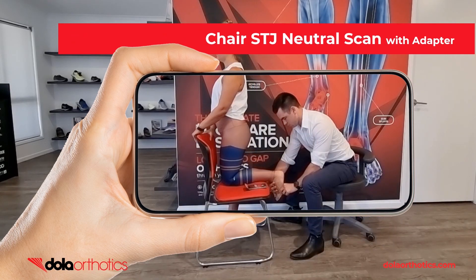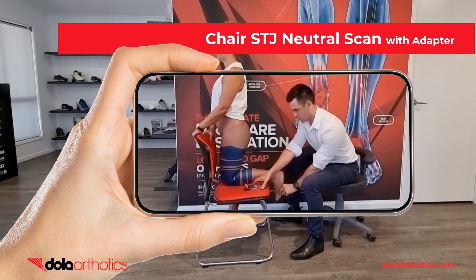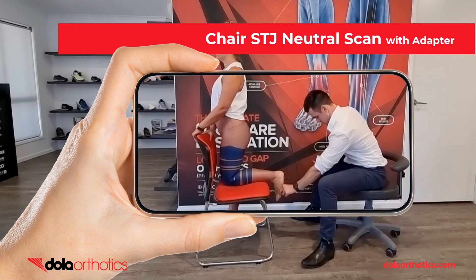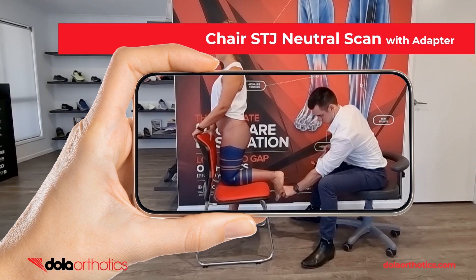Here is a demonstration of the iPhone with Dollar iScan adapter being used to scan the foot using a chair for patient positioning in challenging environments including home visits, consulting rooms and mobile clinics. The clinician is able to hold the foot in subtalar joint neutral just like completing a traditional prone plaster cast while completing the scan. The adapter provides easier visualization of the screen during the scanning process.